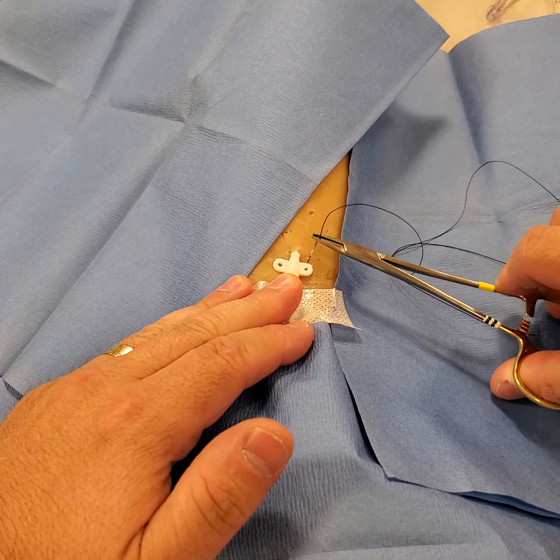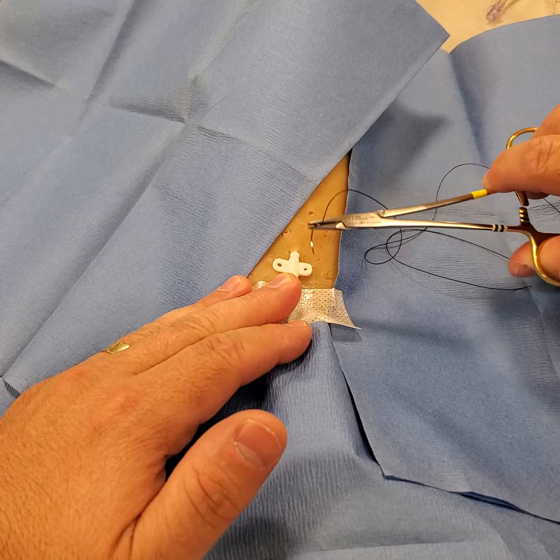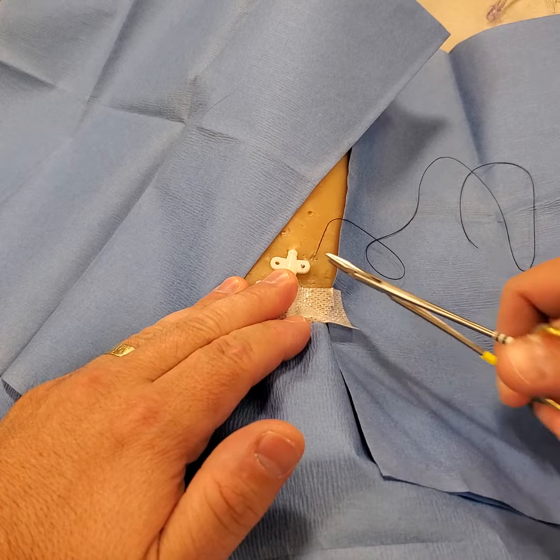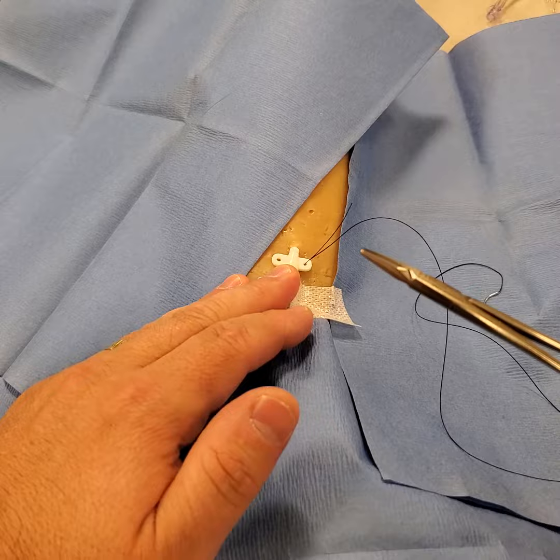Some people have problems getting the needle tip through the hole. You can also go the other way — down through the hole and then up through the skin. My preference is to start from the outside and go in. It doesn't matter if you start top, middle, or bottom — whichever. Just as long as you have a good bite and then come up through the hole, pull, and leave yourself a couple of inches, then drop the needle.